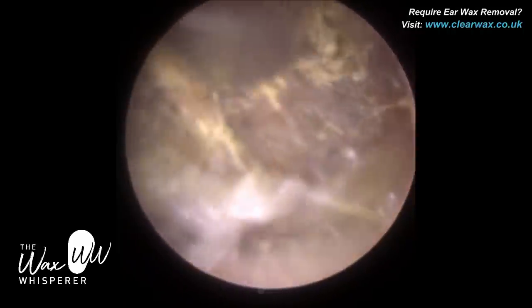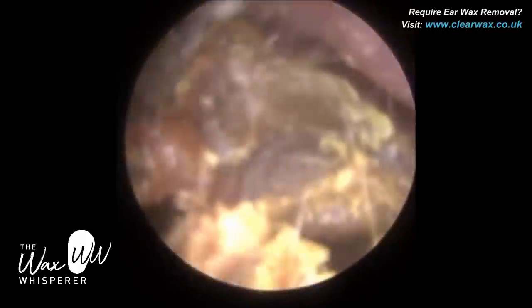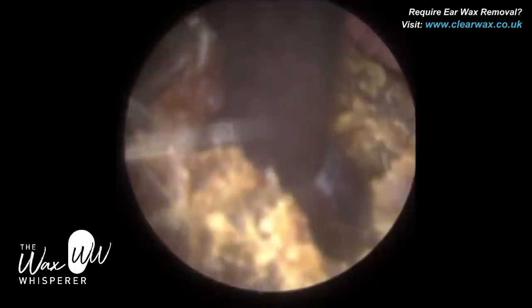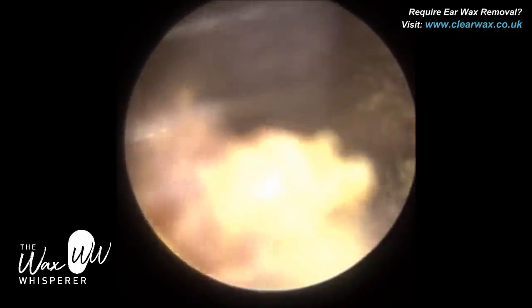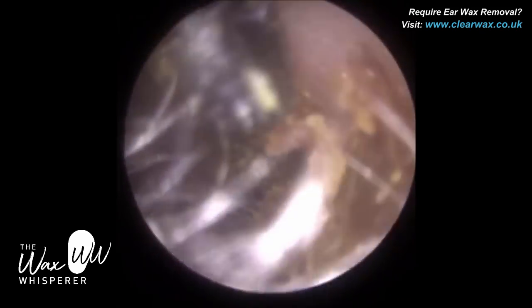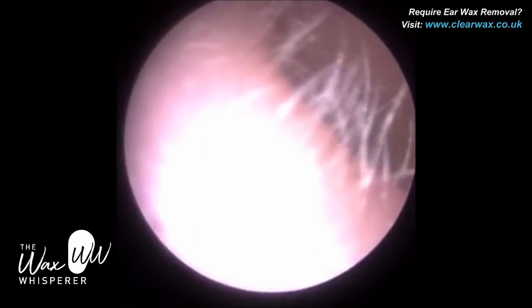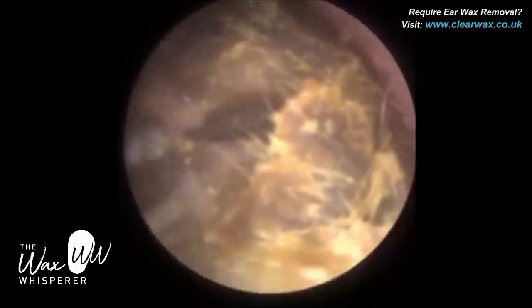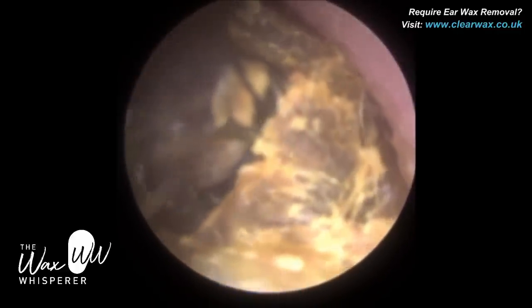You can also see there are a few hairs attached to the surface of the wax — a bit of matted hairs there. The patient has been trimming their ear hairs. If you've been watching my videos, I always recommend: if you do trim your ear hairs, always put a bit of cotton wool — not in your ear, but just at the entrance — to seal the canal entrance so these hairs don't fly into the ear. Because if they do, they matt against the wax, they create a matrix, and it's hard to remove.